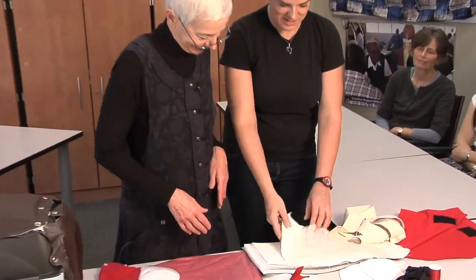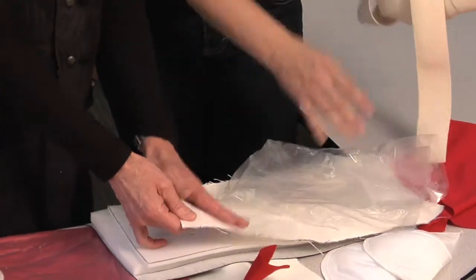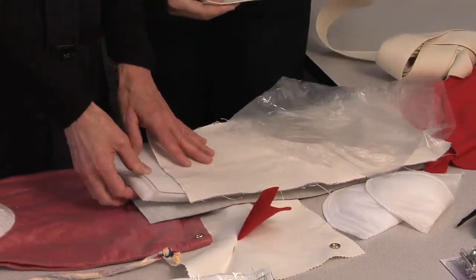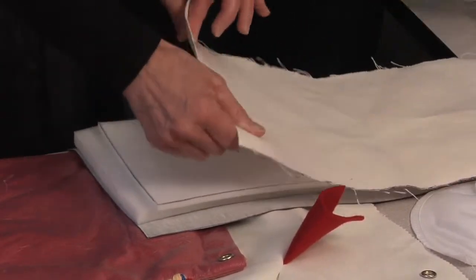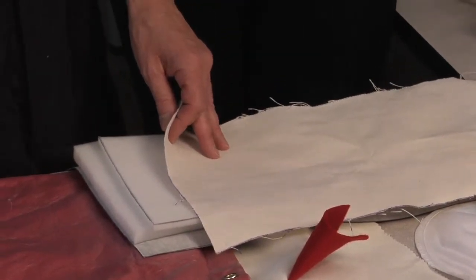Some of us have more fat than others. This is made of canvas — everything is just simple materials put together. This is the layer that goes over the muscle layer, and this is actually the really strong layer of the abdomen. If you only have one piece of suture and you close someone, the important part isn't the skin — the important part is this layer, because this is the really strong layer.